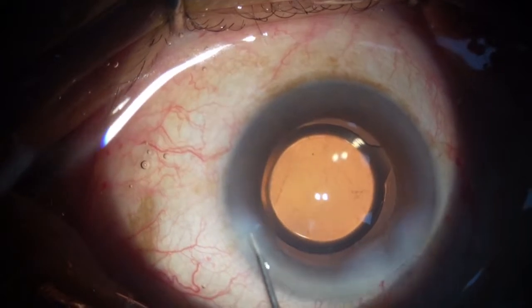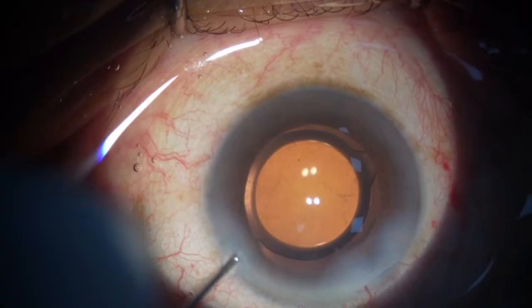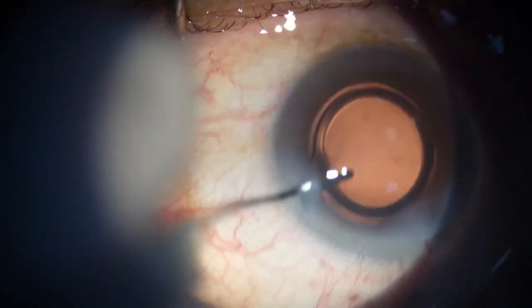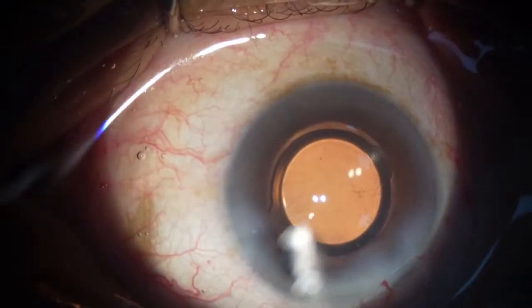So that's my hydration bit, and the last bit what I have to check is that I give a slight nudge to the IOL back into the bag. Yeah, and move it slightly towards the nasal side.